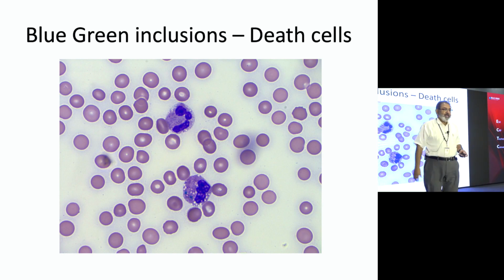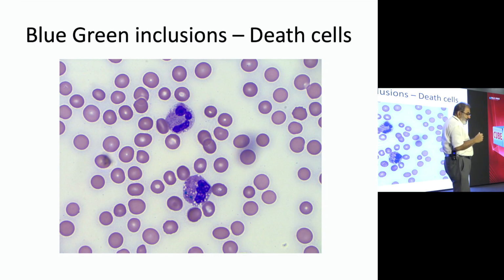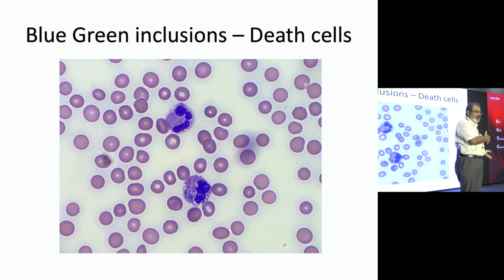So I called him. He's a pancreatologist who has a patient in acute pancreatitis. The liver has gone. So I said, Sudipto, what's your patient having? He said all these things. Why are you calling me, sir? I said, I'm seeing blue-green inclusions. He said, I can't understand what blue-green inclusion is. I said, when you see blue-green inclusions, it means the patient will not survive more than 24 hours.